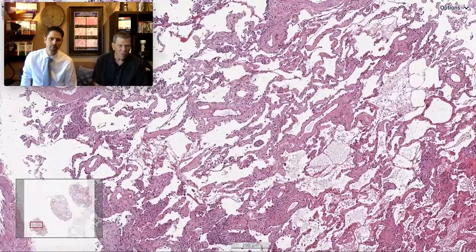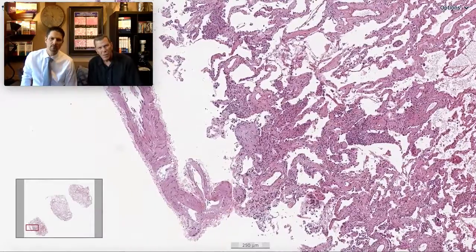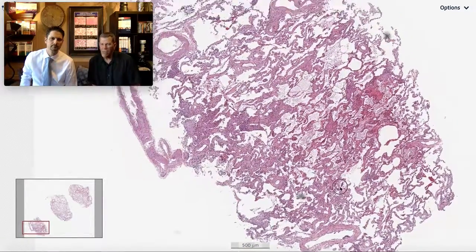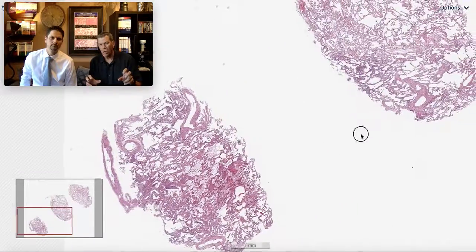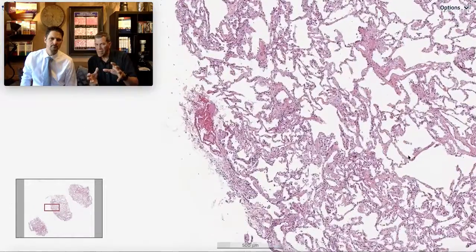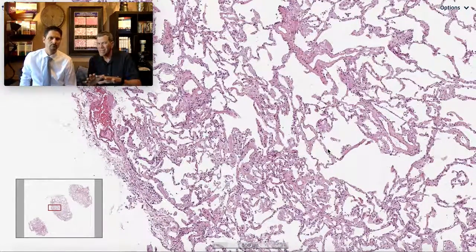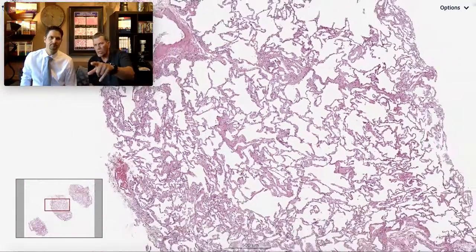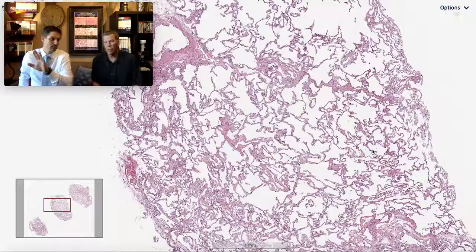I get a sense out there under the pleura there are some spaces, but I think they're not cysts. So we've got irregular NSIP-like interstitial scarring. These biopsies are big enough that we can see this pattern of interstitial fibrosis is not consistent across the whole biopsy. It is present throughout, but there are alveolar walls here that are completely normal in between — which is weird. So it's present throughout the whole biopsy but it's not diffuse and homogeneous.